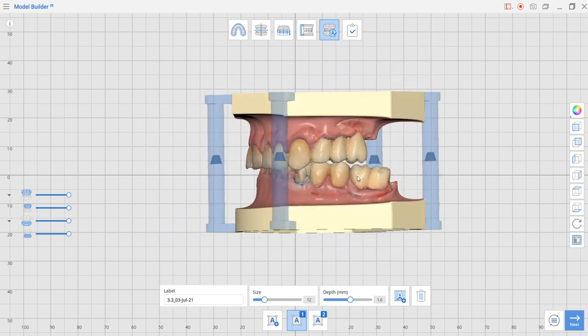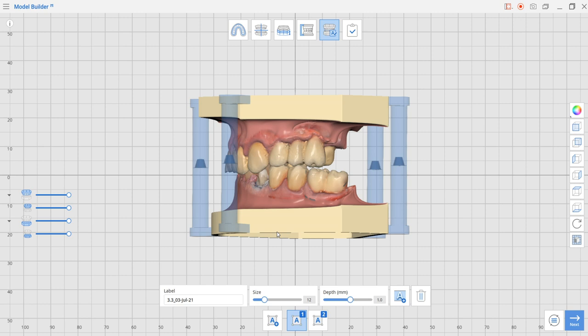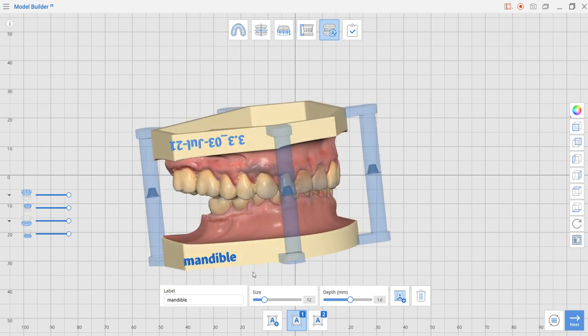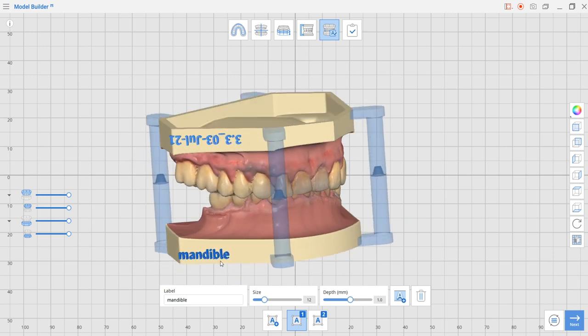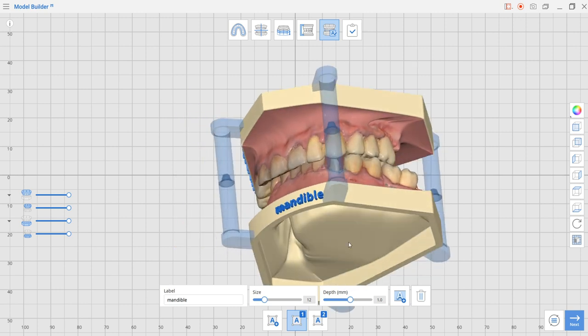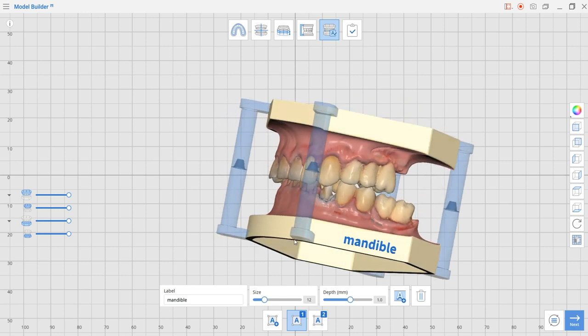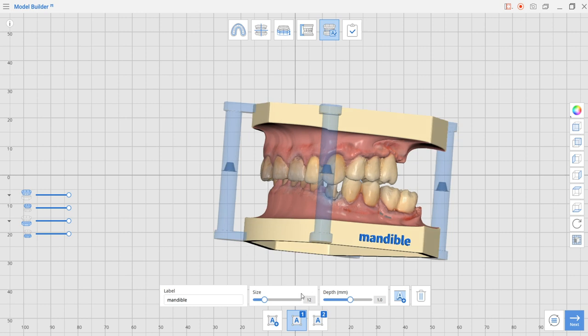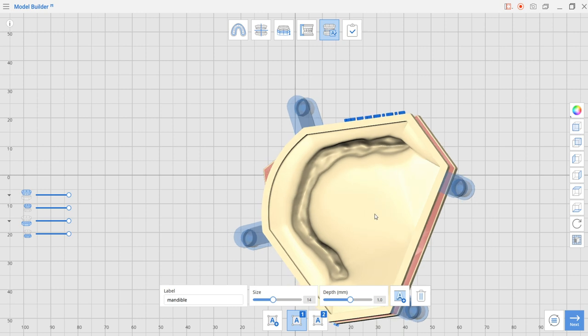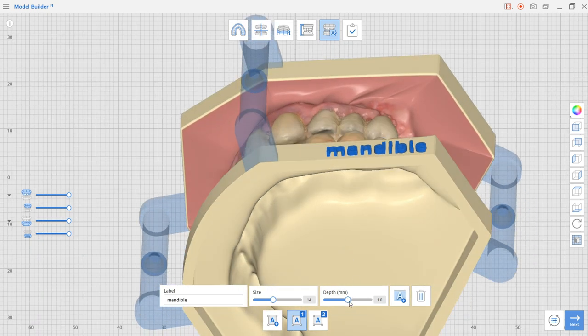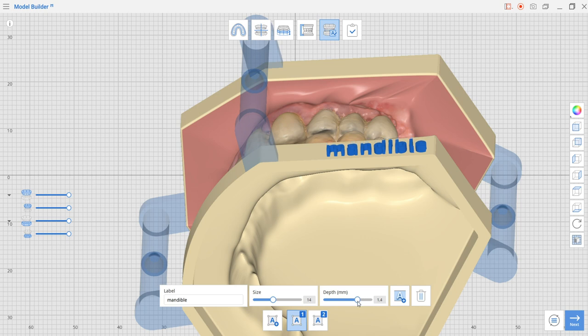On the other part of the model I'm just going to add some more text to show you how it's done. It's draggable wherever you need it. You also can modify the size of the text by dragging the slider and the depth. The depth can come higher or lower, more extruded or not. Let's just leave it to one millimeter.